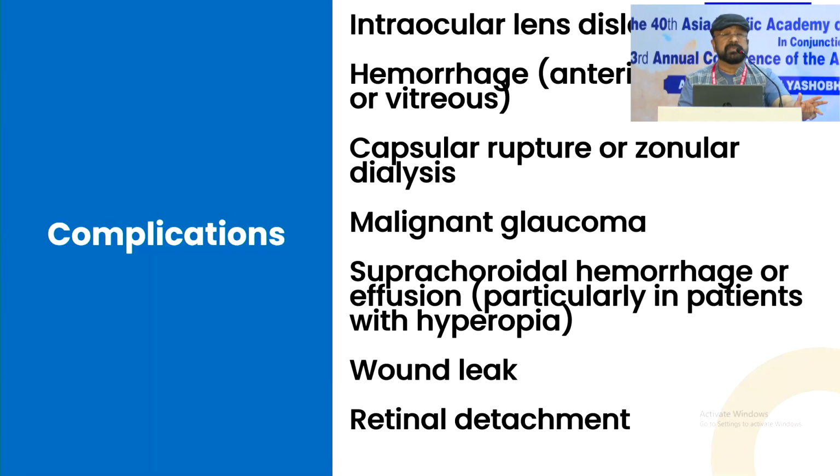Well, there might be some complications that can occur, which is very normal. There might be intraocular lens dislocation, hemorrhage, capsular rupture, zonulodialysis, malignant glaucoma, suprachoroidal hemorrhage, wound leakage, and retinal detachment.